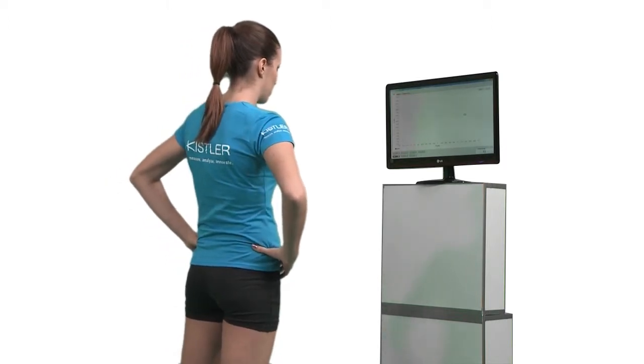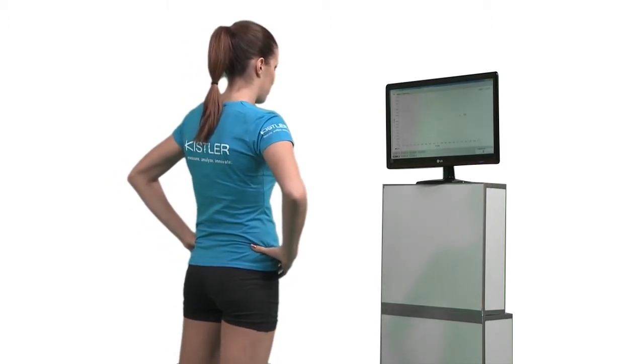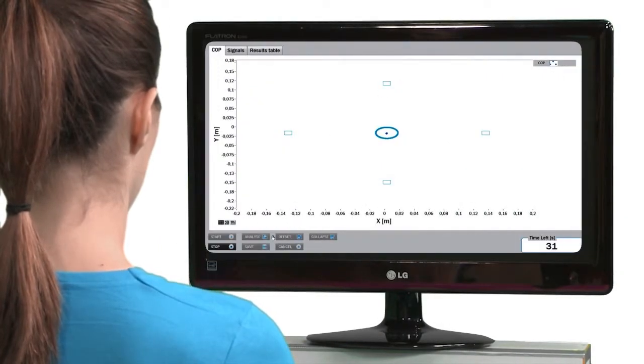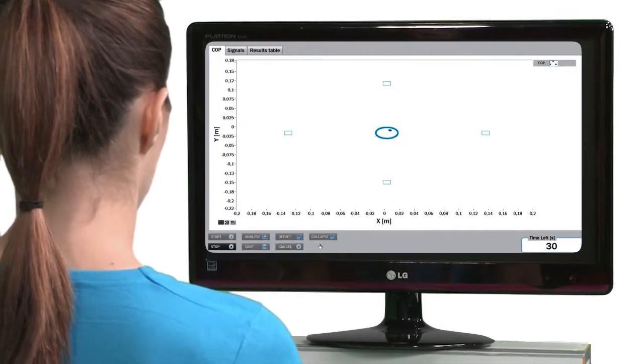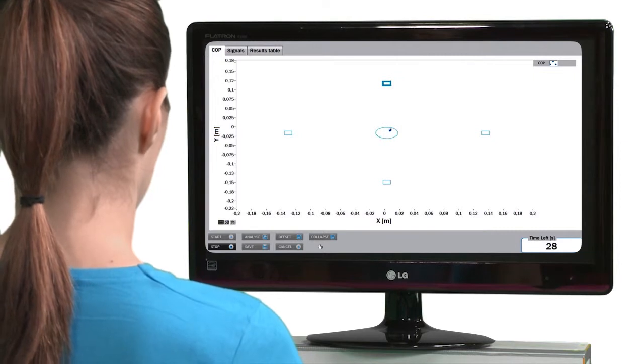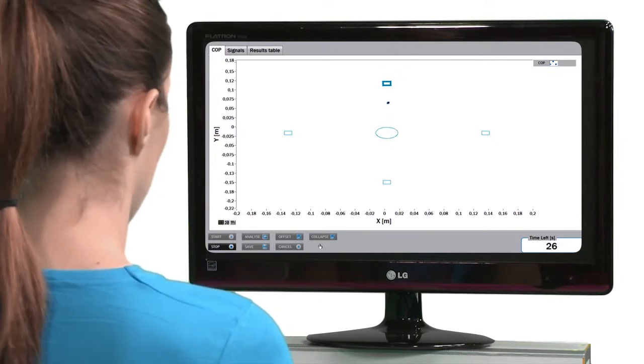Using the limits of stability test module, you can measure the subject's ability to voluntarily shift his or her center of pressure as quickly and as widely as possible.